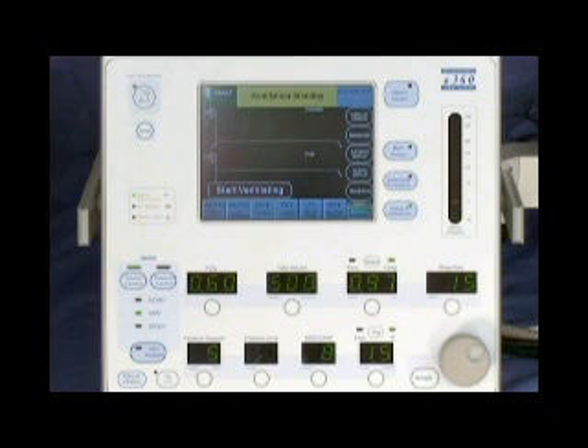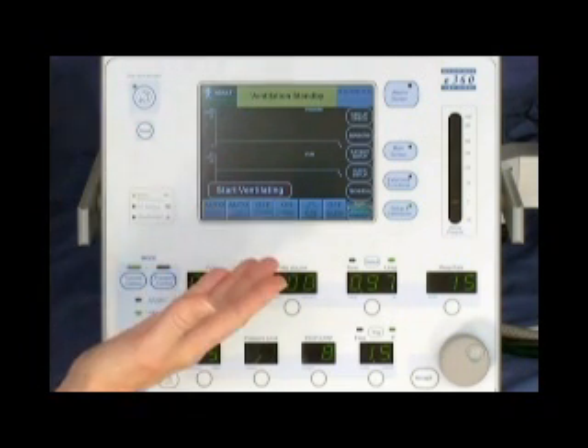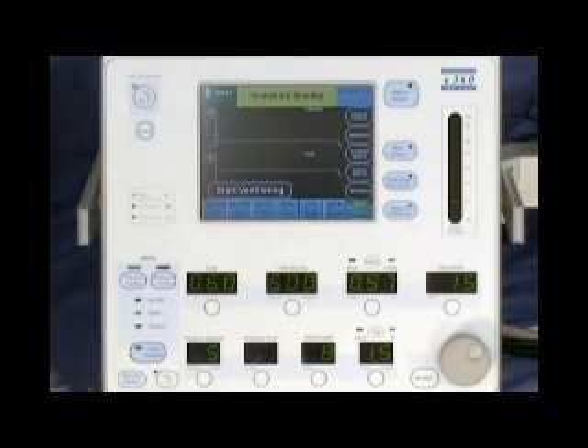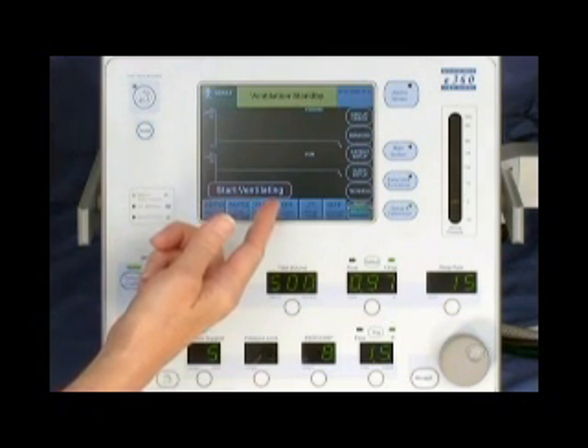The on/off switch is in the upper right corner of the back panel. When the E360 is powered on, it enters the ventilation standby condition. You can leave it in standby for as long as you like. To start ventilating, you just touch the red Start Ventilating button.